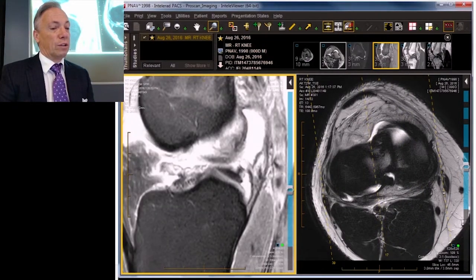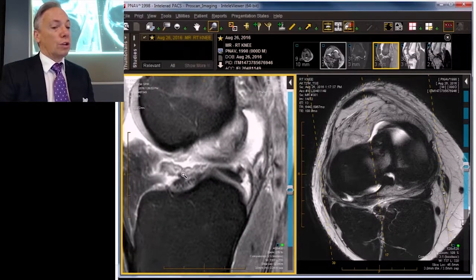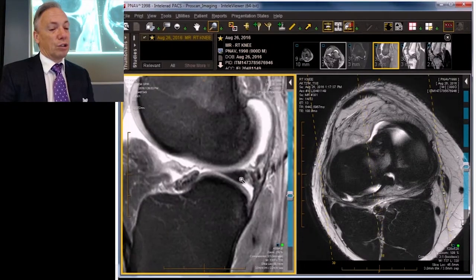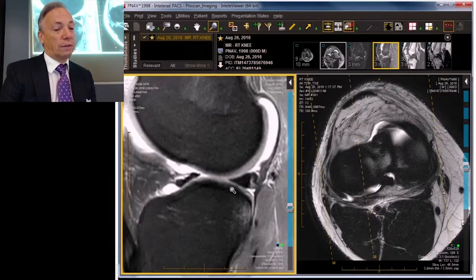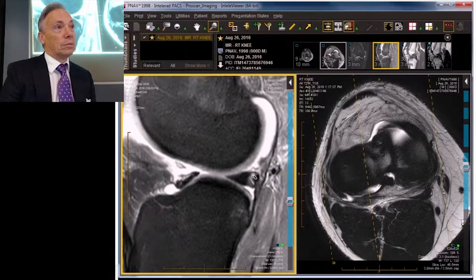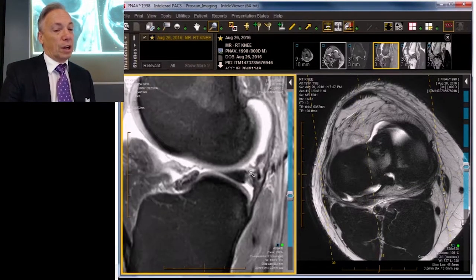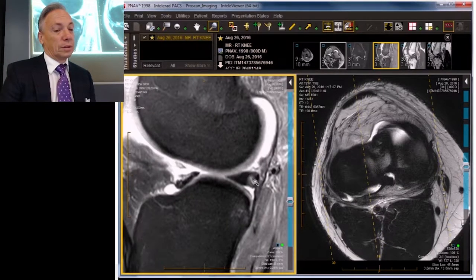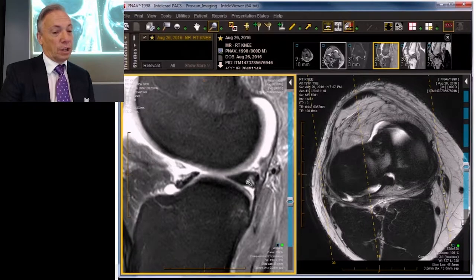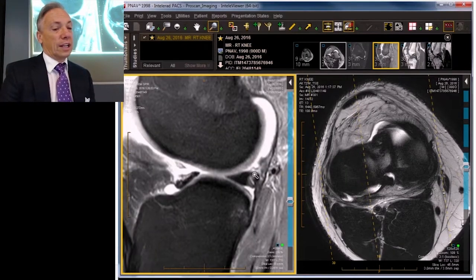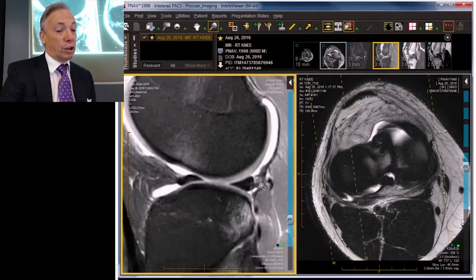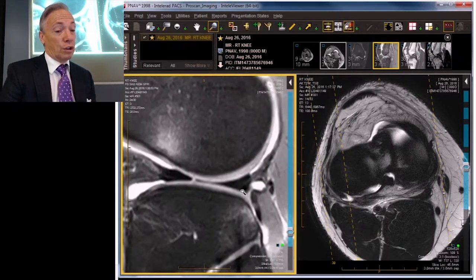As we move to the lateral side, you may notice this large structure that looks like a thumb — that is the anterior cruciate ligament filled with blood, bent forward. We are here at the lateral meniscus root and the posterior attachments of the lateral meniscus. The superior and inferior fascicles are a little stubby and fat — they should be a millimeter in thickness, so they're too thick. Also, the capsule which should tether this attachment right here — see where the tether is broken — so there has been a posterior capsular disruption, and that has allowed these attachments to squiggle up a little bit. They also are torn.